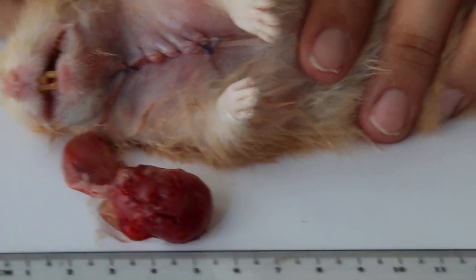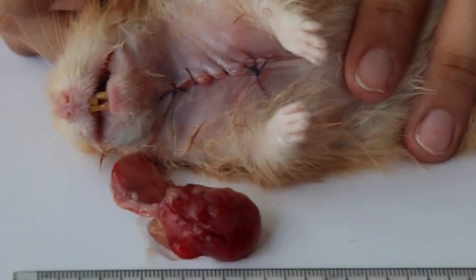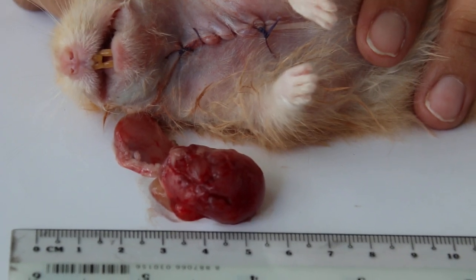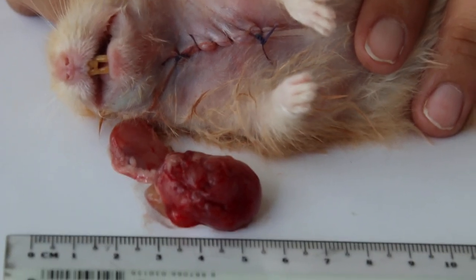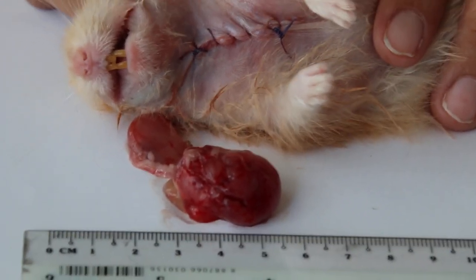So these are the two lumps. Actually there's a big one and then there's a small one. It may be a cancerous lump. The small one is probably the second one. The first one is the big one which you saw. Actually at the side there's another one.